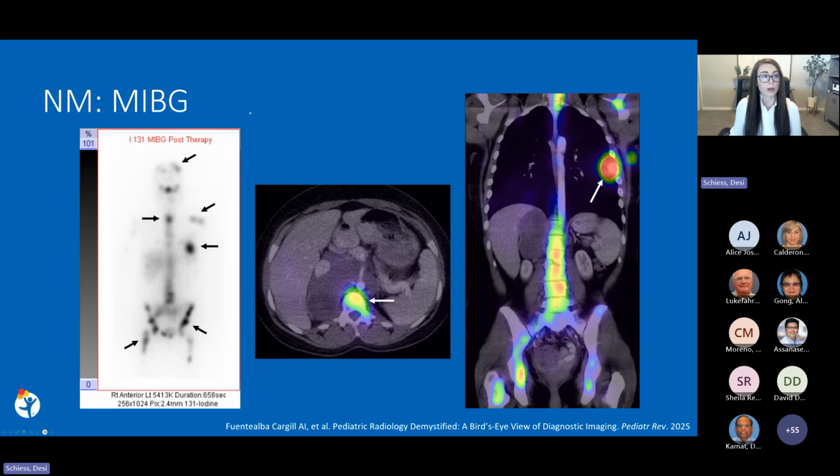This 18-year-old young woman underwent MIBG therapy for refractory neuroblastoma. Whole body planar images obtained 7 days after treatment demonstrate numerous foci of osseous metastatic disease involving the calvarium, left scapula, left rib, pelvis, bilateral proximal femurs, and spine. SPECT images fused with a contrast-enhanced CT enable improved anatomic localization of the areas of MIBG uptake, including the left fifth rib and spine. The primary tumor arises from the right adrenal gland and extends across midline, but was not MIBG avid at the time of this scan.